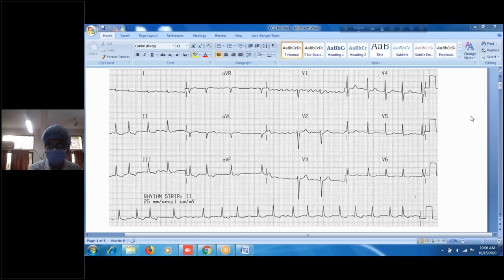It's important. And for this diagnostic workup from the ECG findings, we have already given you the clues, and if I recapitulate these findings again, I can go through these ECGs. This is the ECG of atrial fibrillation. How can we tell this is the ECG of atrial fibrillation?